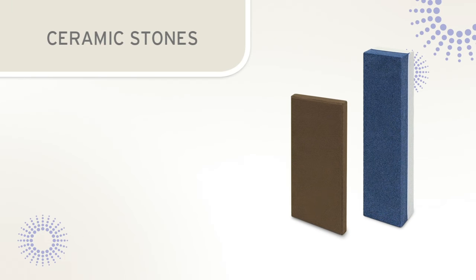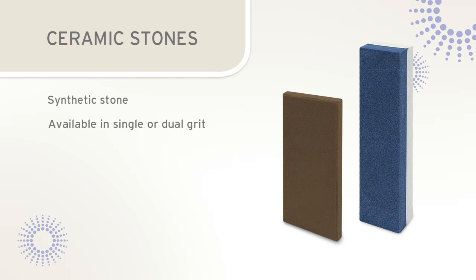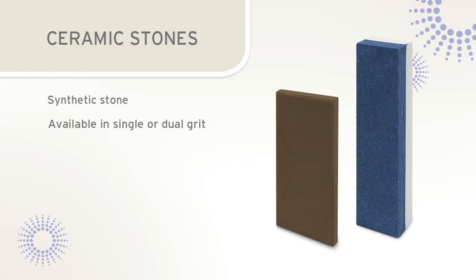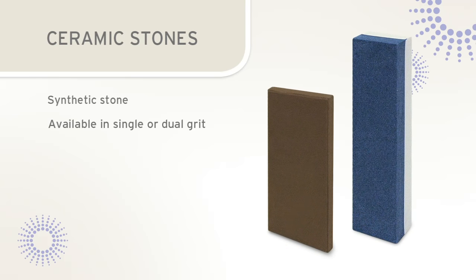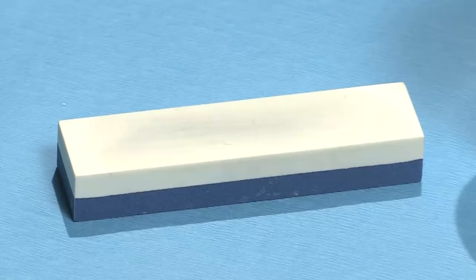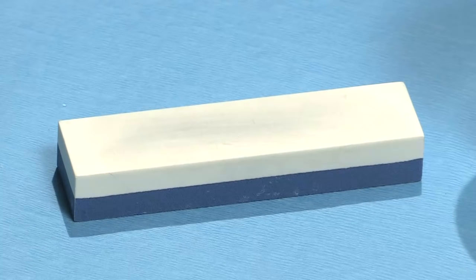Ceramic stones are the newest type of sharpening stones. They are available in a single grit stone or a dual grit stone, whereby one side is a coarse grit and the other side is a medium or fine grit. Oil is not needed for lubrication on ceramic stones, as they can be used dry or with water. This dual grit stone has a blue side that is more abrasive for reconditioning dull instruments, and a white side with a finer grit for light maintenance sharpening.